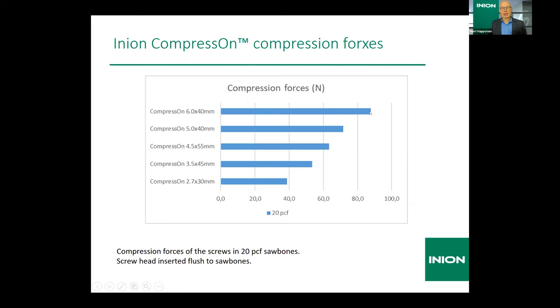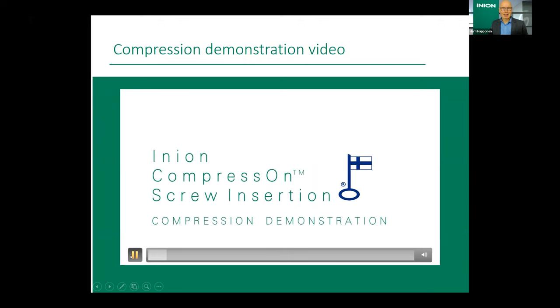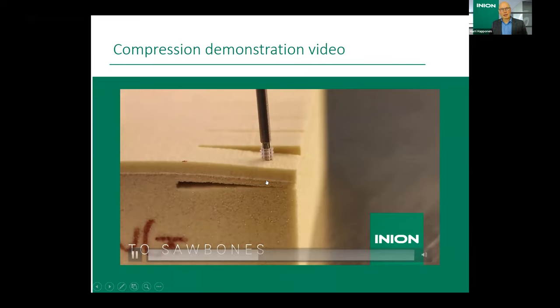And this is then the video clip showing in a real laboratory how the compression is made. This is now the saw bone material, and there is a drill hole and threaded hole in the saw bones. When you insert the screw, it goes nicely into the bone, and finally when the conical head contacts the upper surface, the bone fragment will be compressed to the bone, and then the threaded part will lock the screw and the fracture in place.